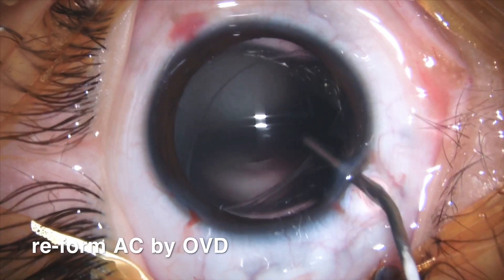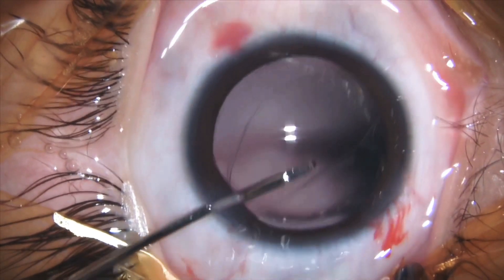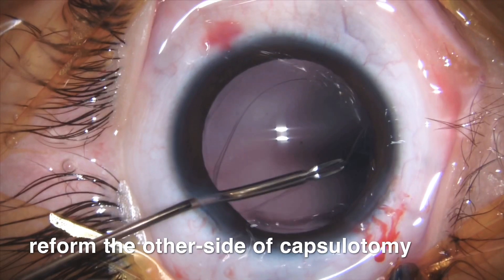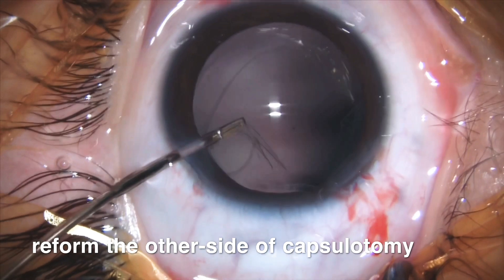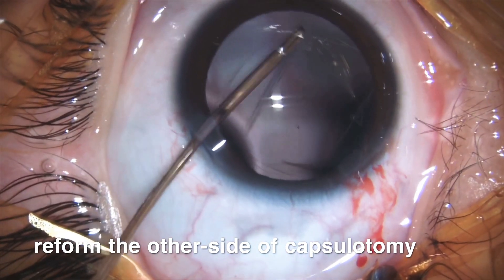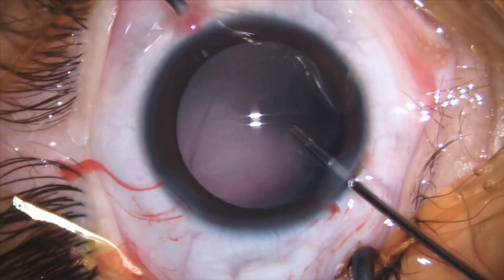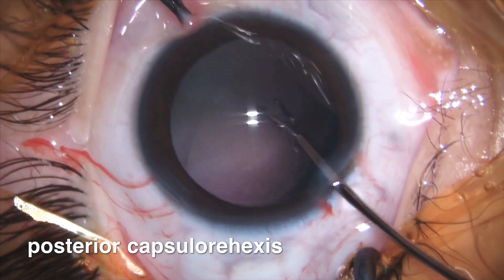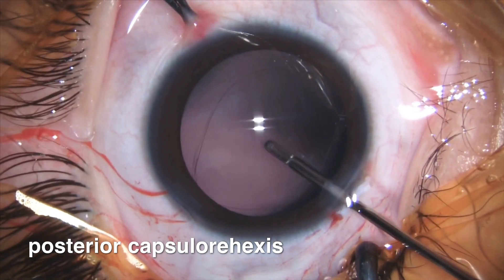Now OVD injection to reform the other side of the anterior capsulotomy. Now moving to the most critical aspect in the surgery: how to perform the posterior capsulotomy.